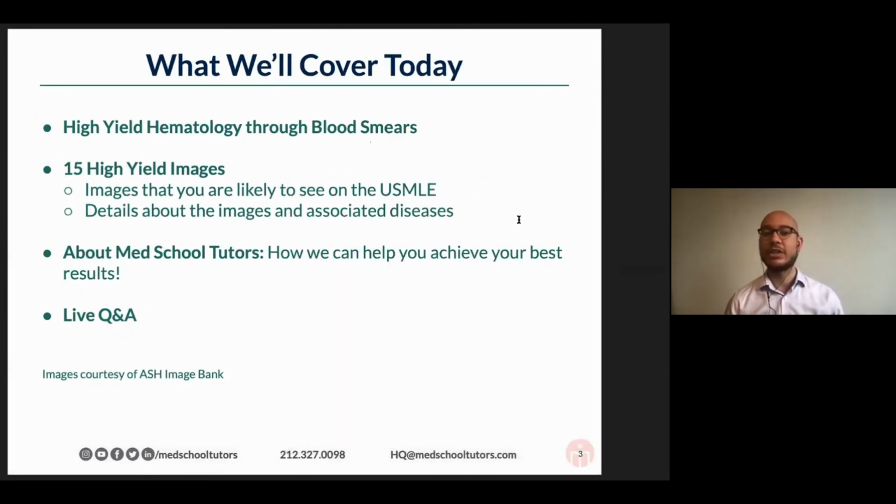The agenda for today will be to cover the high-yield hematology topics that might show up on your examinations through blood smears, both because images can sometimes be intimidating for test takers, but also because they're so rich in the learning that can be had about the associated diseases, the clinical manifestations, as well as the basic science that you all need to know.